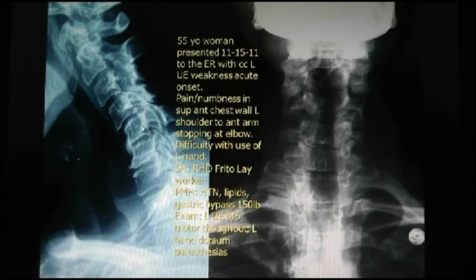Now, looking at this lateral radiograph, though, there's no reason why I would expect it to be one side more than the other. It could be. Why not bilateral? At this point, sure. Do you see anything else, Adam? There's some degenerative disc disease with anterior osteophytes at 6-7 and 5-6 as well. 5-6 and 6-7.